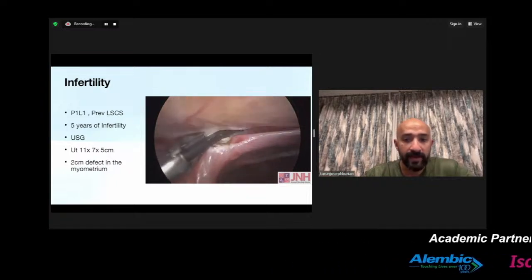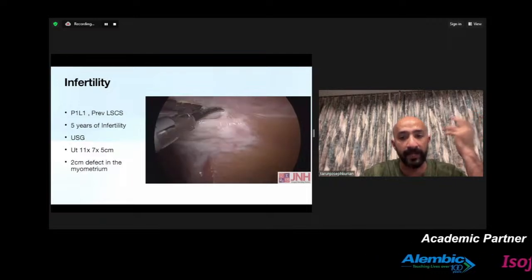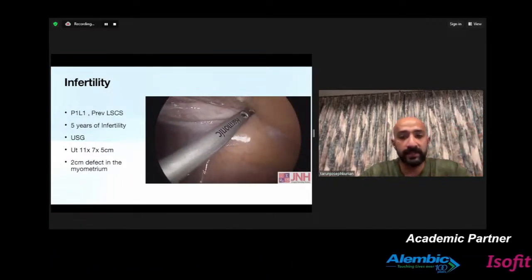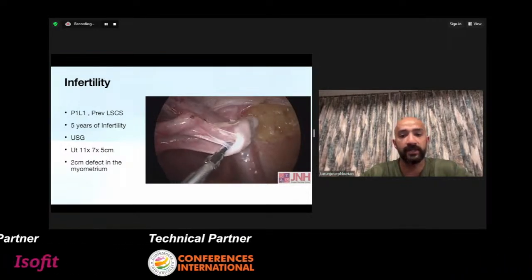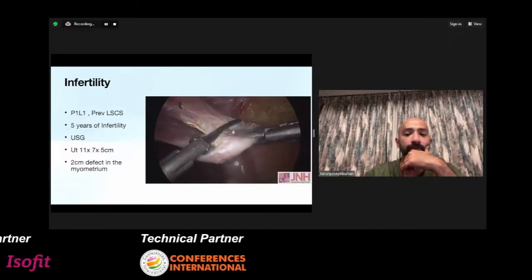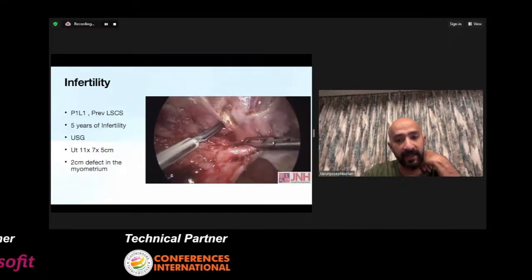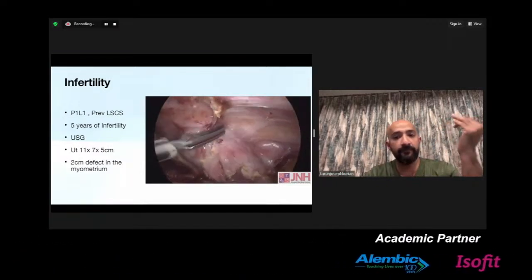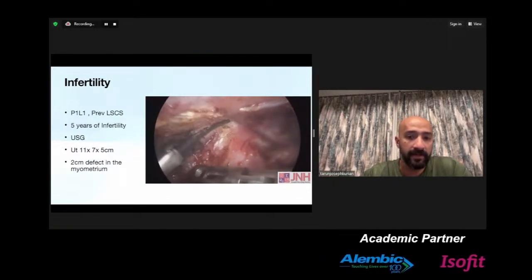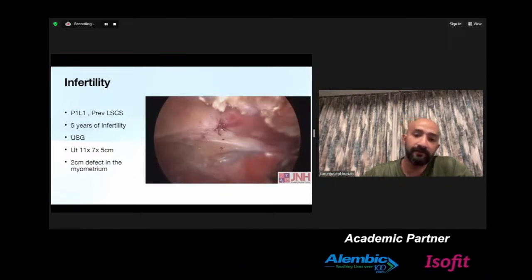In these cases, you can use vasopressin to try to prevent blood loss, but most of the time, as long as you stay in the right plane, getting an avascular plane is not too difficult. So you can see in this case, along with the ovary, everything was stuck up and she had 5 years of infertility. The tube was involved in the adhesion and hence was far away from the ovary, and that could possibly explain the infertility that she's having. But also, cesarean scars are one of the causes of infertility. So even without any other cause, the fluid from a scar could affect fertility.